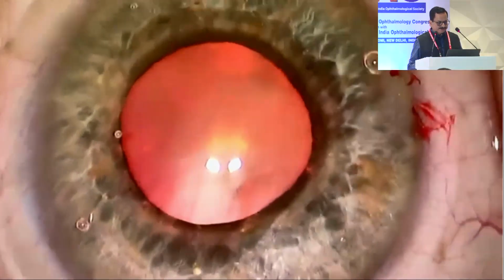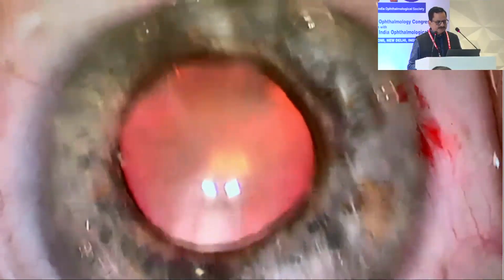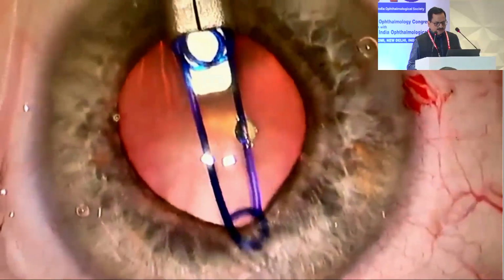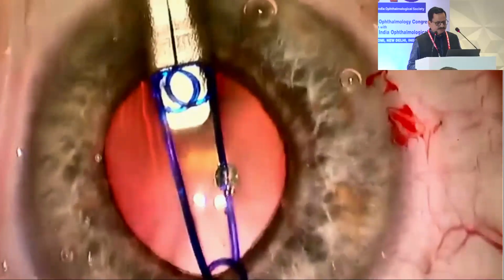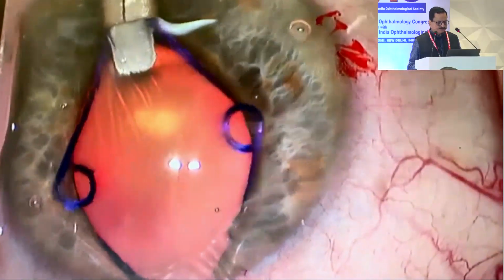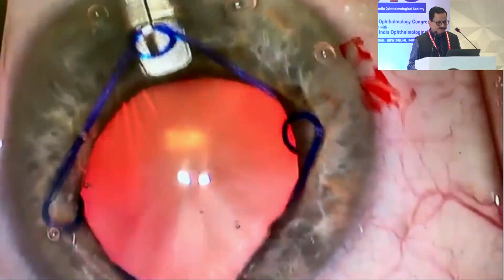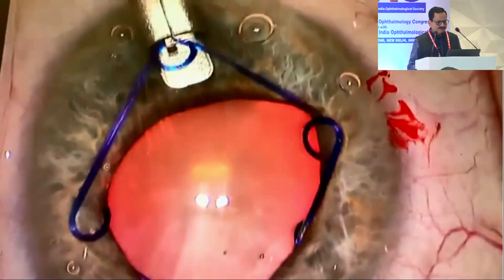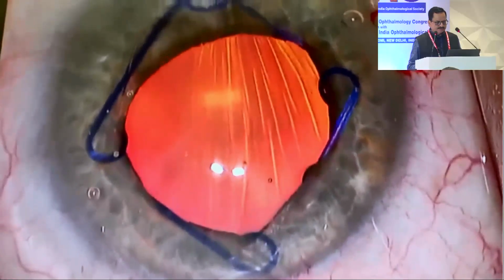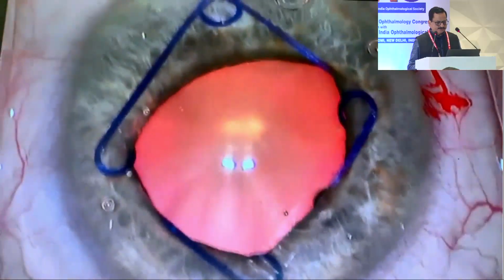This is Dr. Kachikian from the Eye Institute, and what you're seeing here is the early part of a cataract surgery with a small pupil. The device we are placing here is called a Malyugin ring, and we use this ring to expand the pupil to allow us to access the cataract and remove the lens safely. Each eyelet of the ring hooks onto the iris and holds it out of the way so we can do the procedure. As you can see here, once we get the last eyelet hooked, the iris is retracted very well.